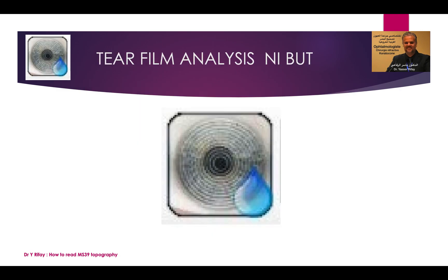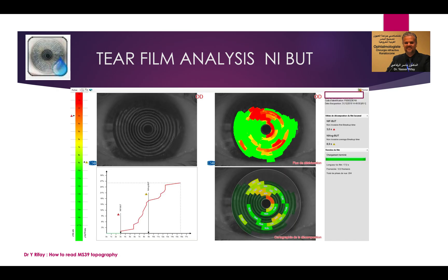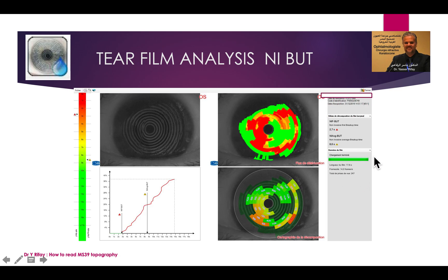Tear film analysis, or non-invasive breakup time, is very helpful in dry eye. You can see an abnormal non-invasive breakup time with evaporation of the tear film. You have a curve showing the non-invasive breakup time — the first tear film that evaporates gives you that time, and this is the average. Numeric data helps you diagnose and follow up dry eye.